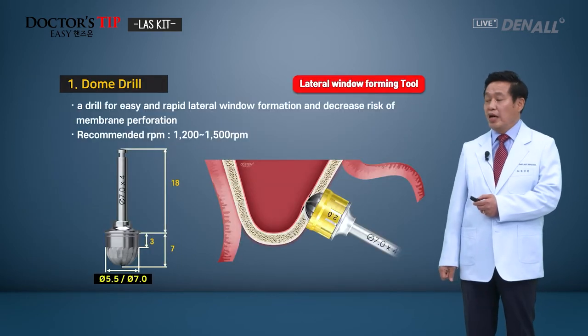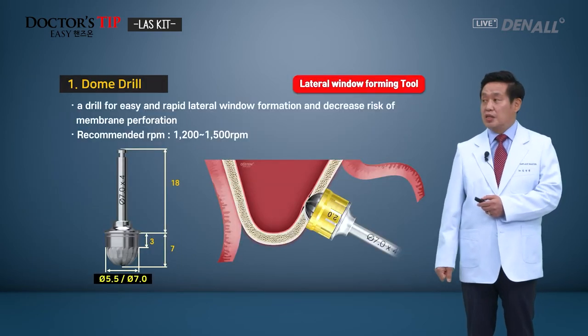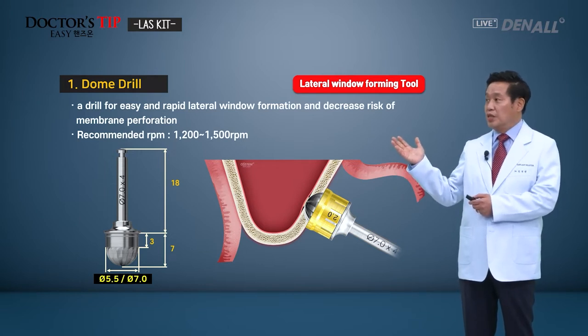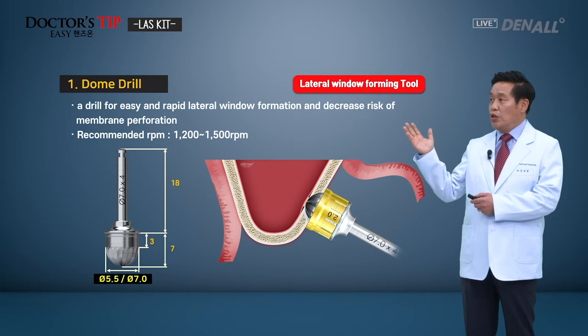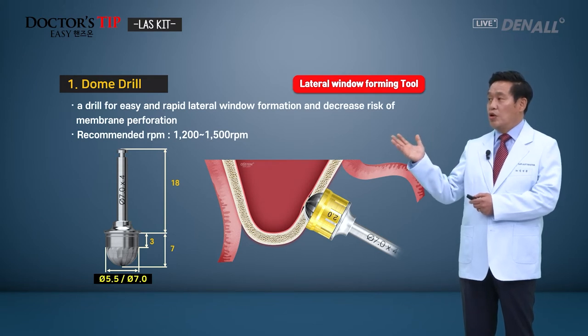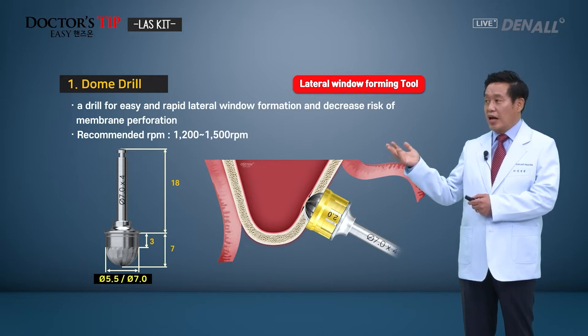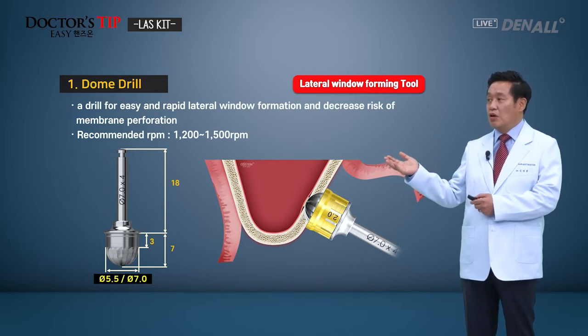So first, let's talk about the dome drill. In the last kit, there are two types of drill. First, the dome drill is where you can more easily and quickly form the window, and perforation of the membrane or membrane damage can be prevented. So it grinds the lateral window.